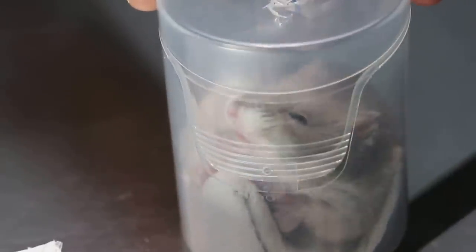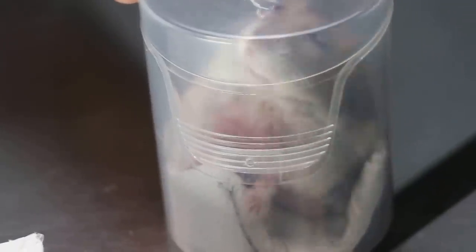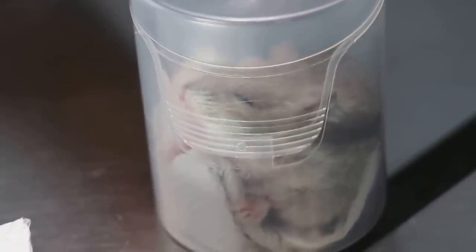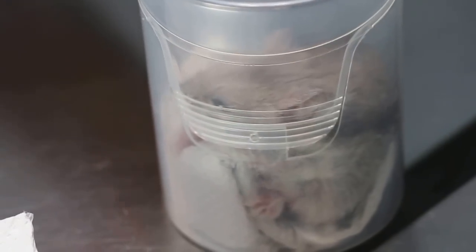But as you can see now, the assistant must be very observant. Once the hamster is down only — okay, down, enough already — then no need to wait until the fellow is flat out there. Quickly take out and clip as much as possible.